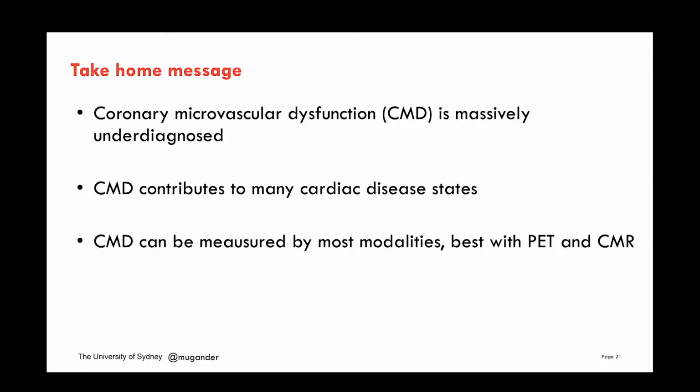It's a large opportunity for us in the non-invasive imaging space to up our game, to learn more about its prevalence and pathophysiology and potential treatments. And it contributes to many cardiac disease states. And it can be measured by most modalities, but arguably best with PET and CMR in its current embodiments.